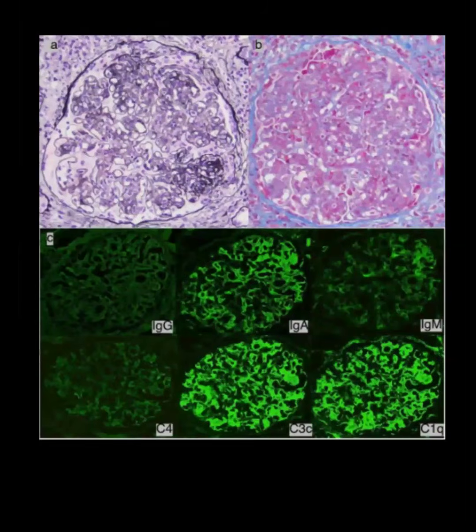Okay, so when they give a question in an exam, sometimes they give both things. They can give the histopathology and they can give you the immunofluorescence. So here you can see IgA and C3 deposits, and C1q is present, along with endocapillary proliferation as well. So C3 deposits along with IgA and C1q deposits. Which disease can it be? It can be IgA nephropathy. It can be MPGN, post-streptococcal GN. MPGN as well. Very nice.